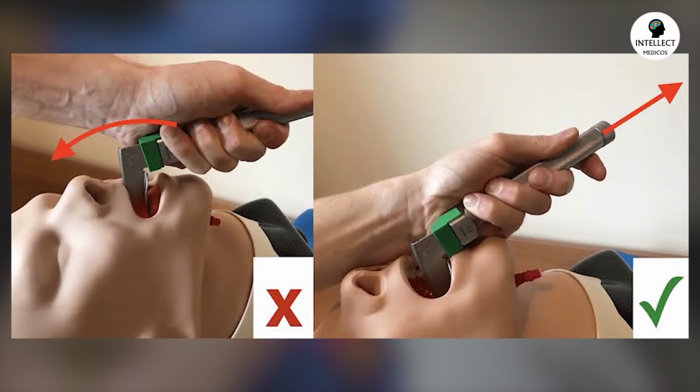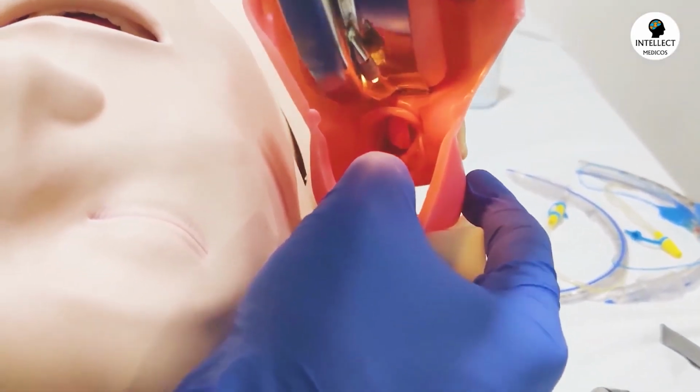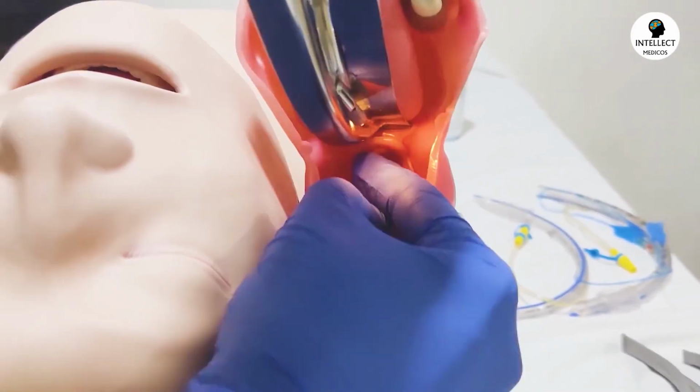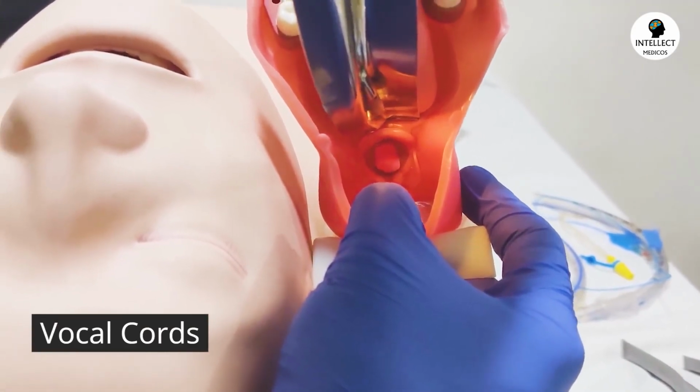So when you reach the vallecula, you don't have to twist your hand. You just have to pull it at 45 degrees angle as shown in this pic. Because if you hinge it or if you use the incisor as a lever, then you can cause trauma to the teeth or even break the teeth. So never twist your hand, just pull it at 45 degrees angle so that you are able to see the vocal cords over there. So that V-shaped structure is the vocal cord, and you can see the glottic opening.